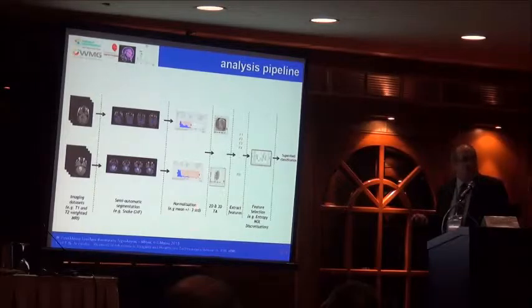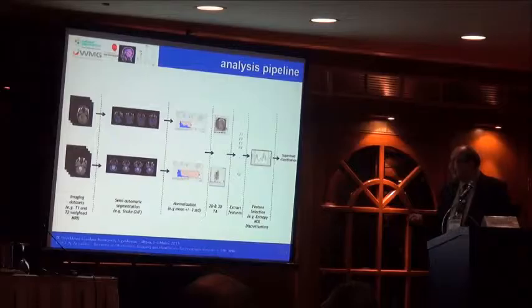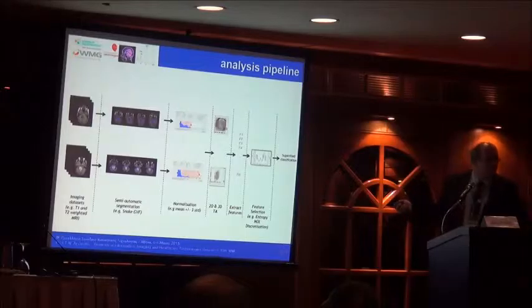And we need to normalize it because, unfortunately, although we use the same protocol, MRI is so sensitive to the condition that there are minor variations in the intensities you have in the original space. So we need to normalize it so that they are comparable. Then decide if you do two-dimensional or three-dimensional texture analysis, extract the appropriate features, and then use a technique to do feature selection, then throw it into the classifier or do it in the workflow. So that's the idea behind that.